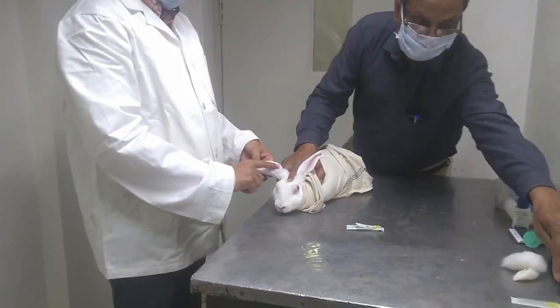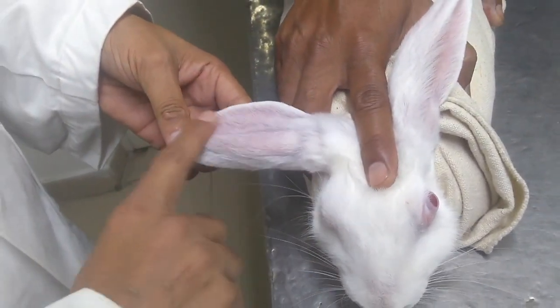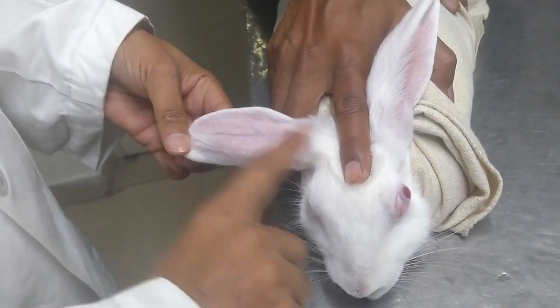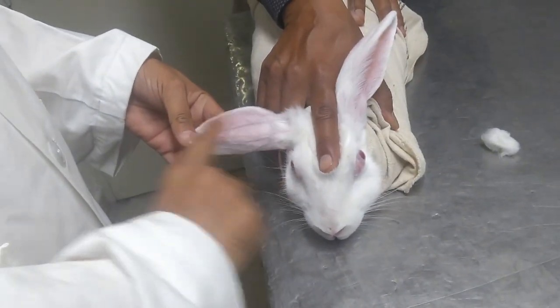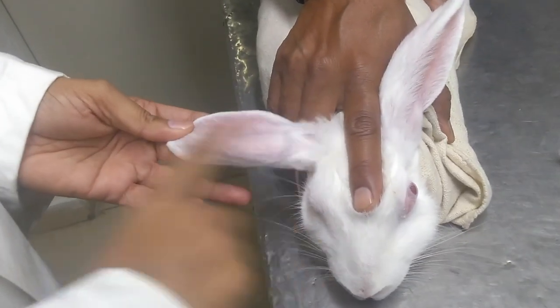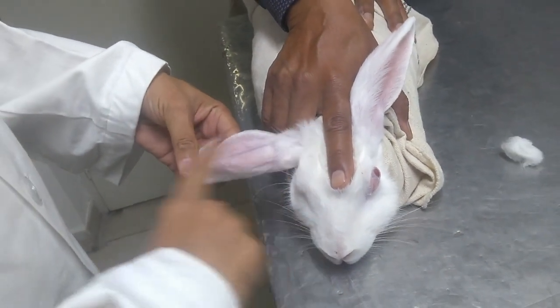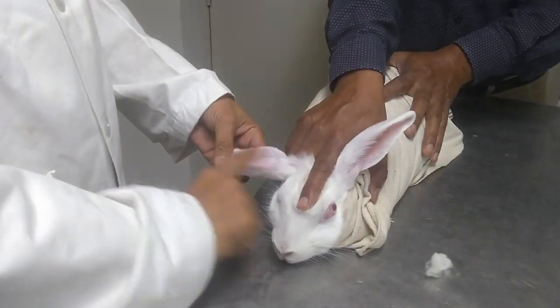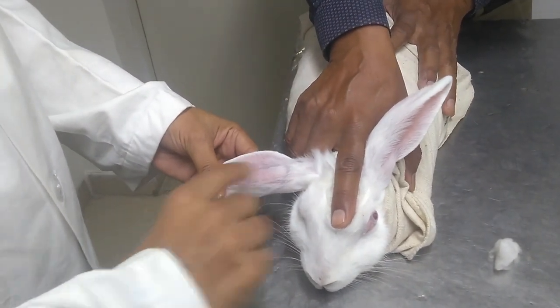We will bleed the animal from this mid ear vein, and we rub it so that it gets heated up and the circulation is faster. The vein will also expand and more flow will be there. So this is the method which we normally apply. When the vein is properly visible, this is the mid ear vein from which we will bleed.